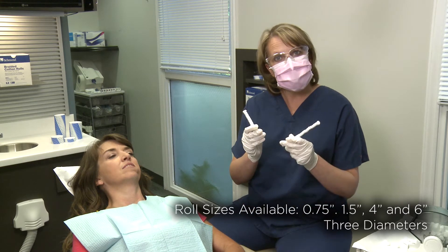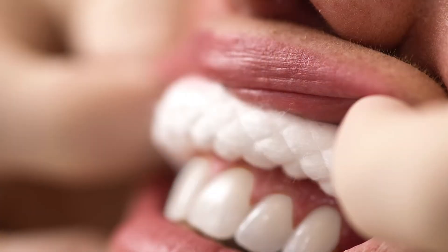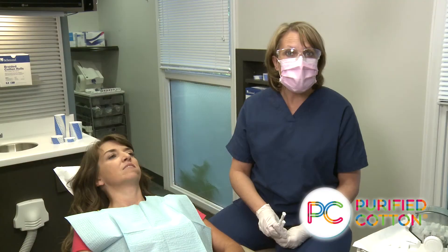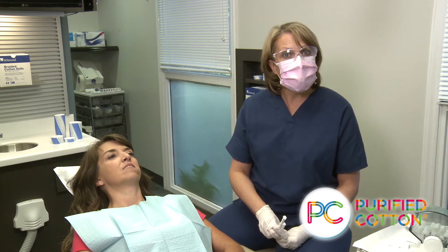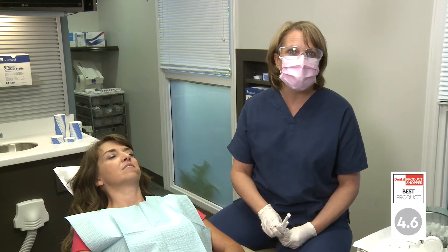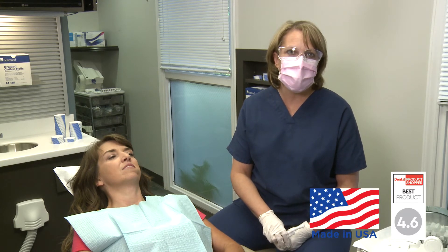We also offer a pediatric size. Richmond's unique four and six inch braided rolls are commonly used for bleaching as well as full arch reconstruction. Made of medical grade, purified cotton, Richmond's braided rolls receive the dental product shoppers Best Product Award and are proudly manufactured in the USA.